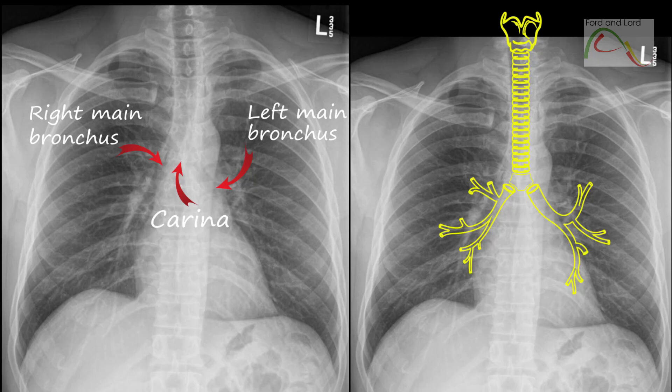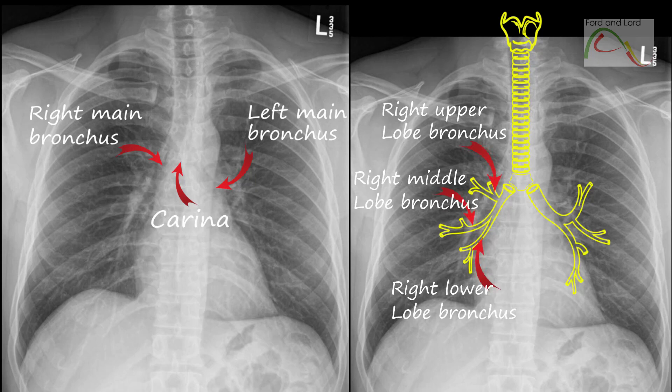The right main bronchus is wider and shorter than the left main bronchus, which is thinner and longer. The right main bronchus subdivides into three lobar bronchi, while the left main bronchus divides into two.